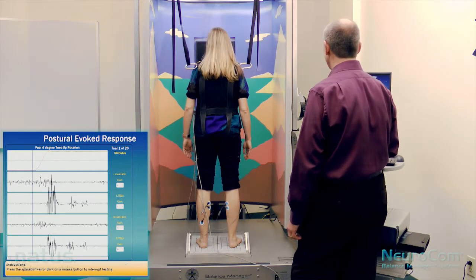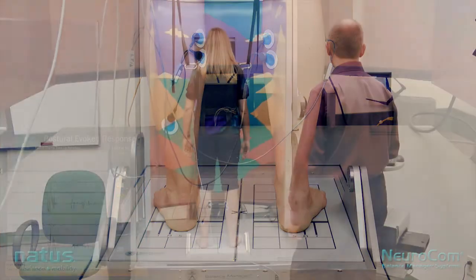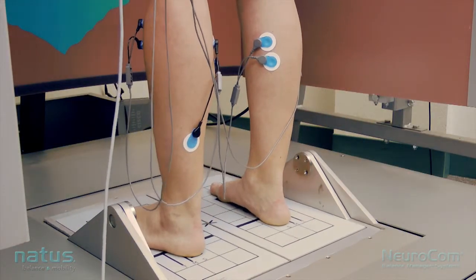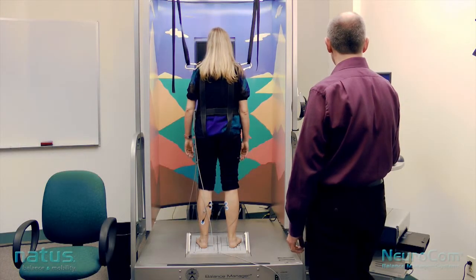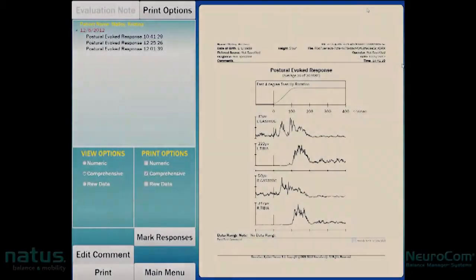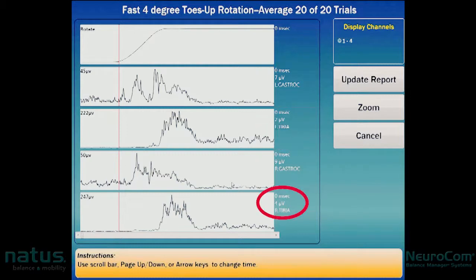The test runs 20 trials. This is data analysis for the Postural Evoked Response Test. From the comprehensive screen, click on 'mark responses,' which will show you averages of platform rotation, left gastroc, left tibialis, right gastroc, and right tibialis over the 20 trials.